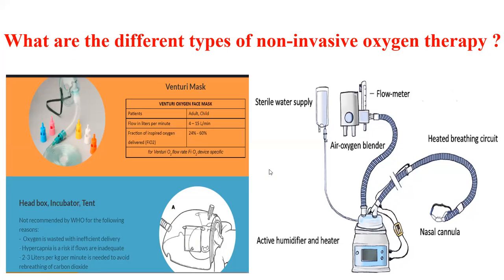We can also use a high flow nasal cannula. I think maybe it's not common in our health settings, but soon they may have it. As you saw in the drawing, the high flow nasal cannula has almost 4 parts, and it can humidify and regulate the temperature of the oxygen delivered to the patient. Next slide.